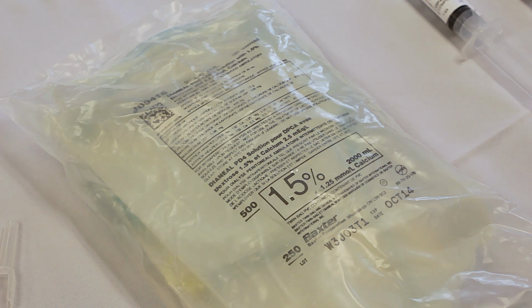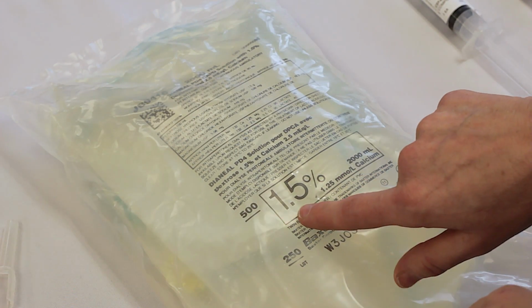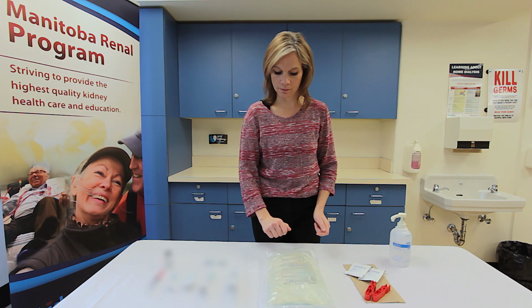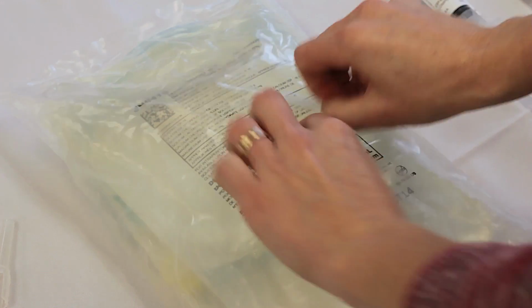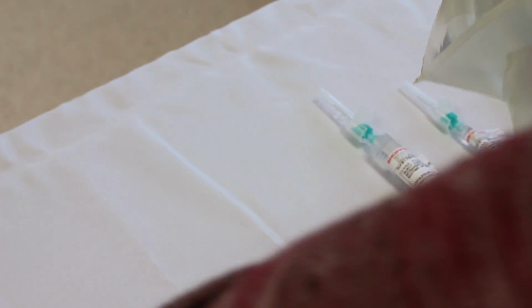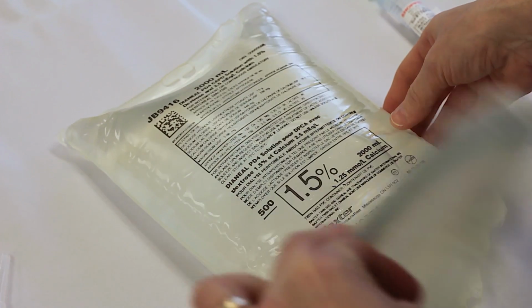Before opening the outer wrap of dialysate solution bag, ensure the correct solution volume, dextrose concentration, solution type, temperature, and expiry date. Remove the dialysate solution from the outer wrap. You can use the corner of the clean clamp to slice the outer wrap. It will not cut the dialysate bag or tubing. The twin bag is steam sterilized, and there may be some residual moisture from that process in the outer wrap. If there are more than 2 teaspoons of liquid in the outer wrap, discard the dialysate solution set.